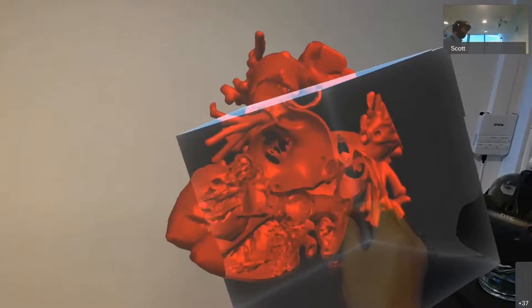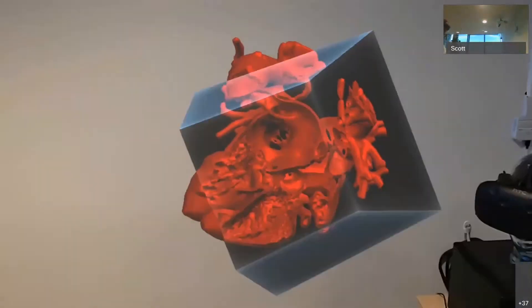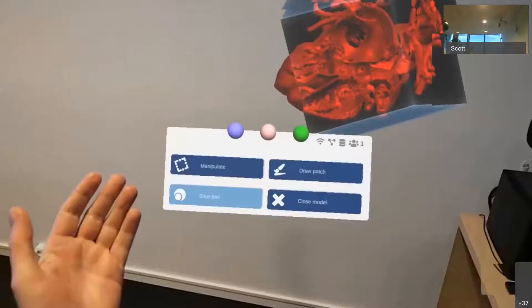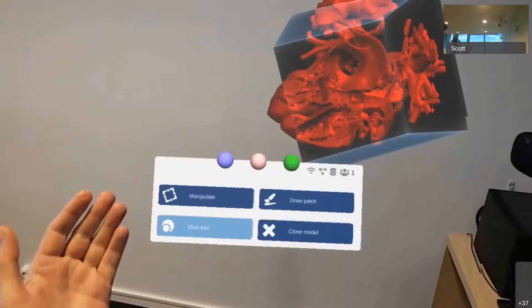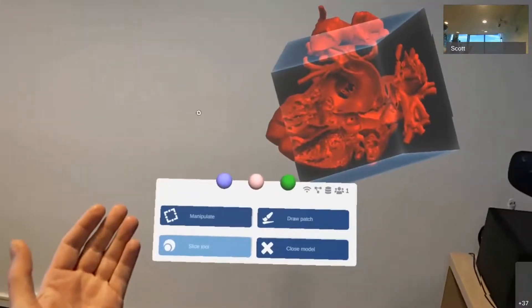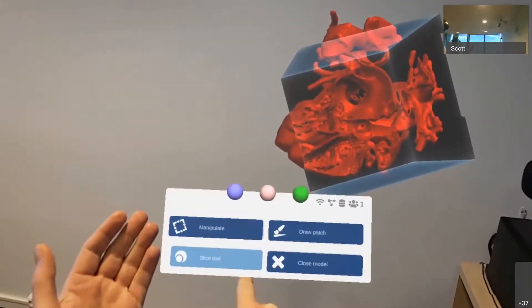I think I'll make it big so I can slice all the way through the heart. OK, I think that looks like a good view. So bring up the context menu again, disable the slicing tool so that it disappears.